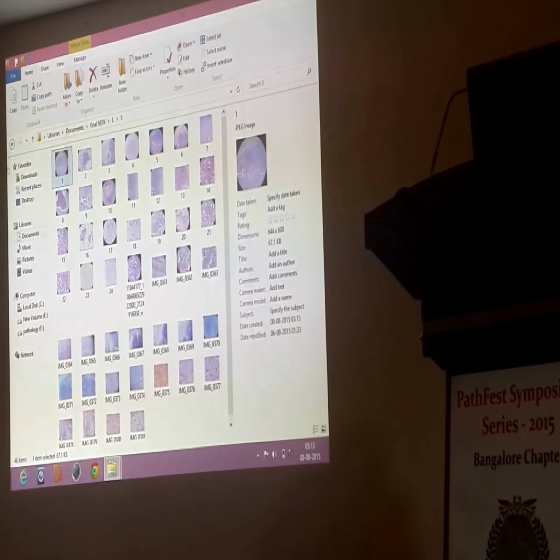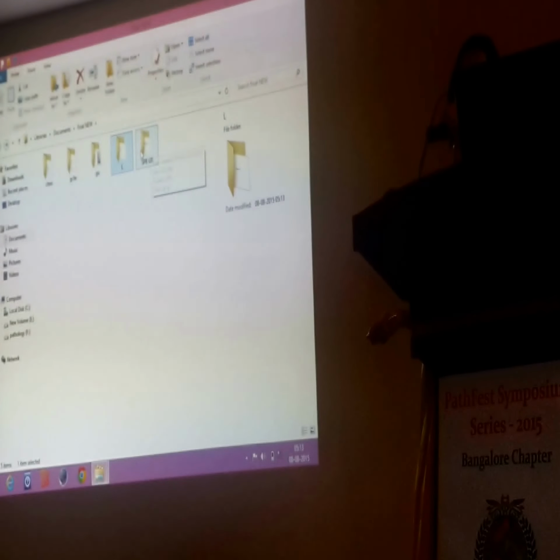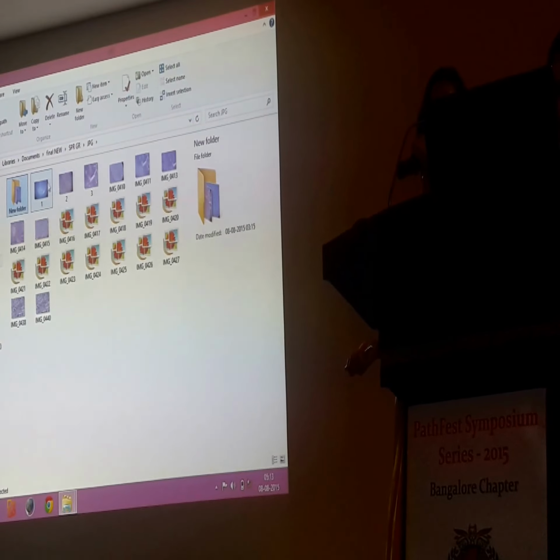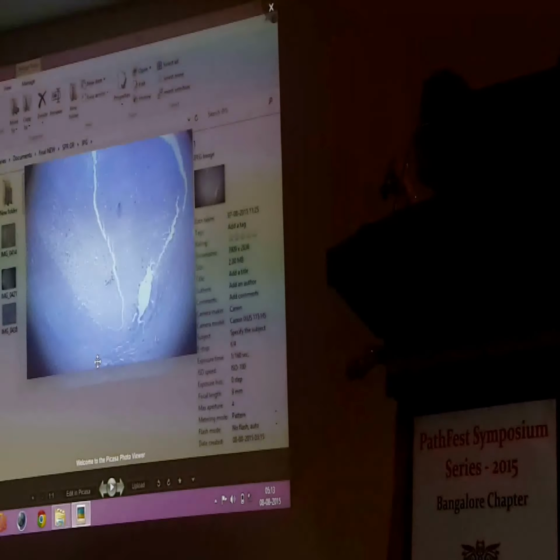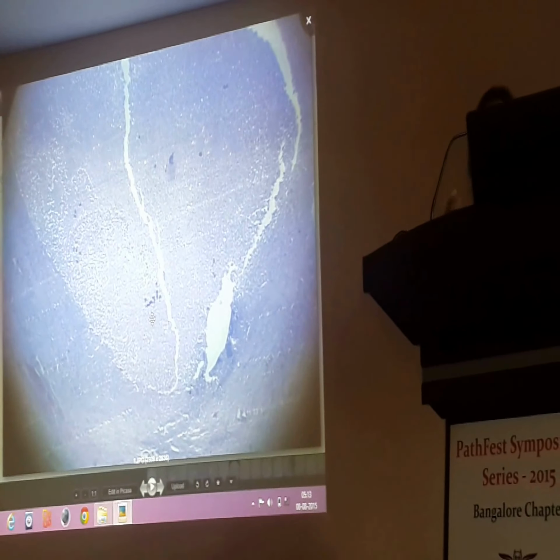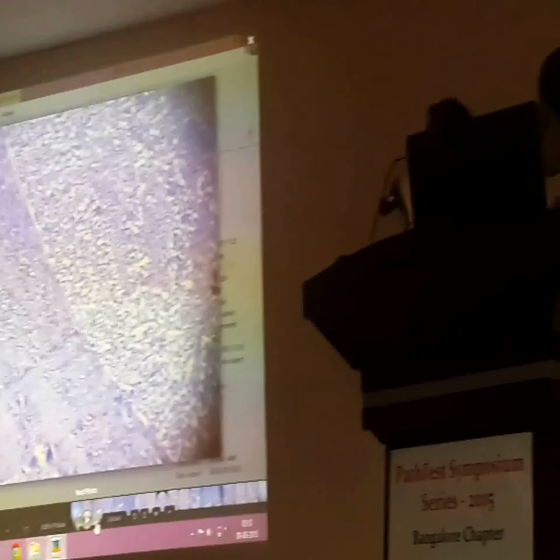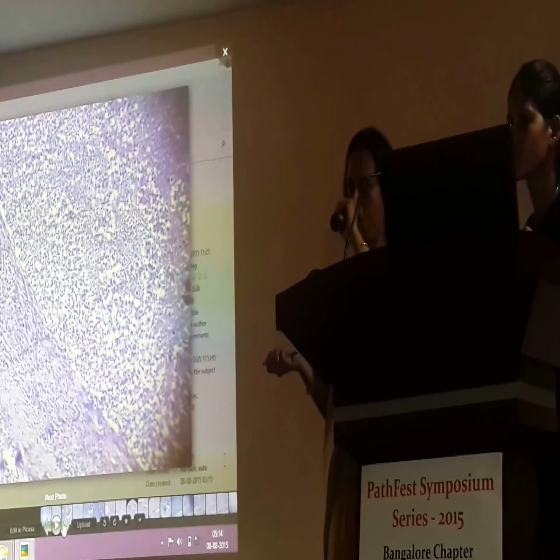The last slide is only for identification. Before this, just see this. Yeah, this, I said, is for morphology, morphological appreciation. You see the luminal structure? It has something. Move. What does it contain? Maybe some cells which are looking like neutrophils.